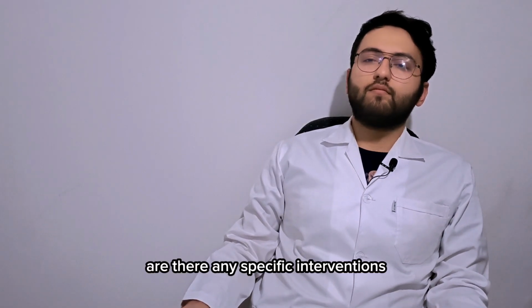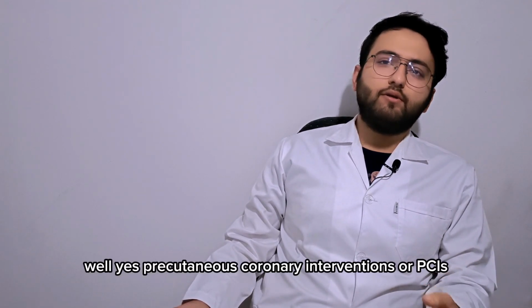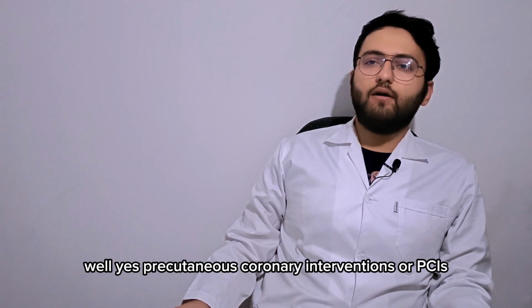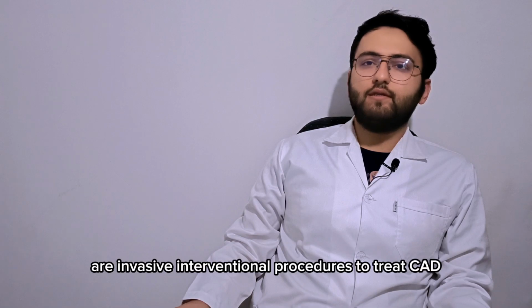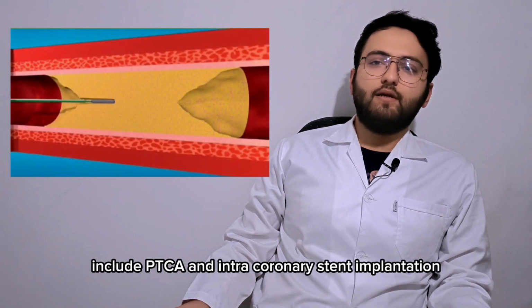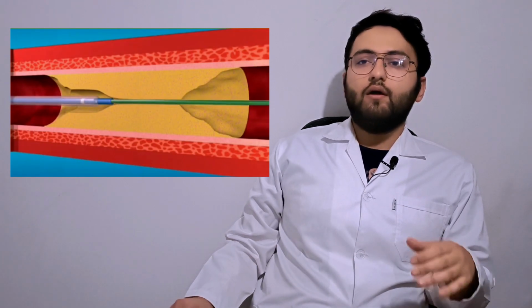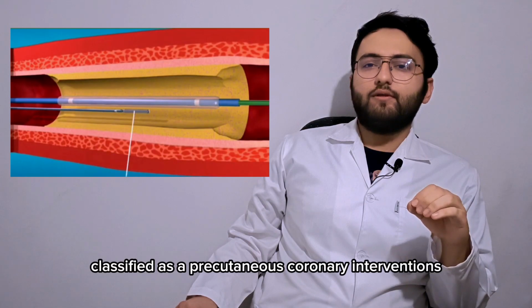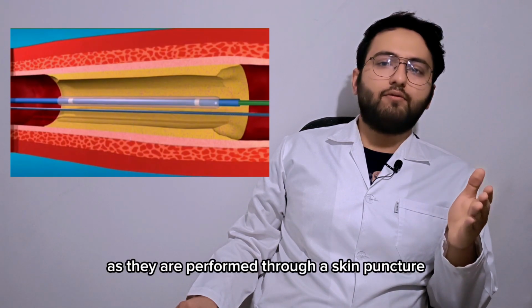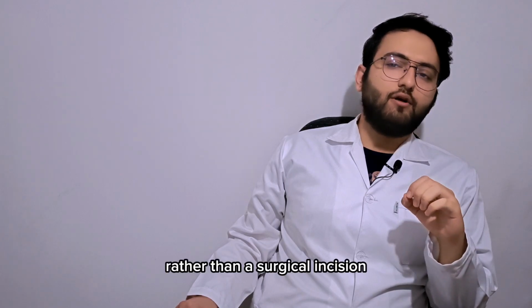Are there any specific interventions associated with cardiac catheterization? Well, yes, percutaneous coronary interventions or PCIs are invasive interventional procedures to treat CAD, include PTCA and intracoronary stent implantation. These procedures are classified as percutaneous coronary interventions as they are performed through a skin puncture rather than a surgical incision.